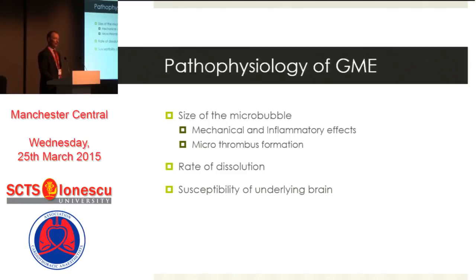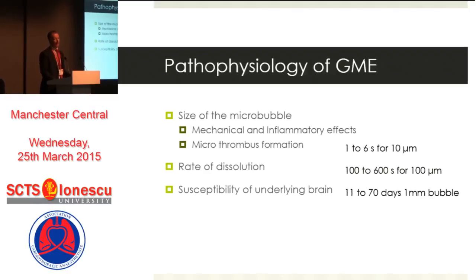So does any of this matter? It matters depending on the size of the microbubble, and I will be looking at that in a little minute. Based on the size of the bubble, it determines how long it takes for the dissolution of that bubble to occur. You can see if you have a 10 micron bubble, it can take just 6 seconds in the circulation to disappear. But if you have a 100 micron bubble, it can take up to 10 minutes to disappear.